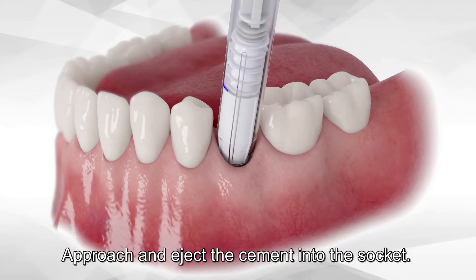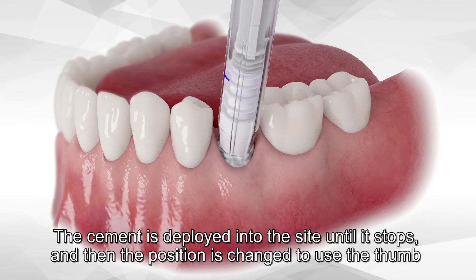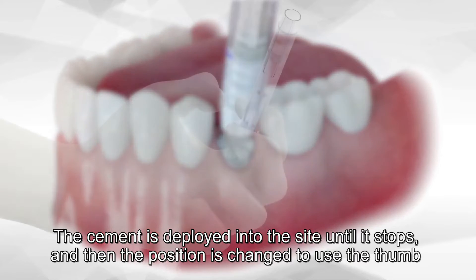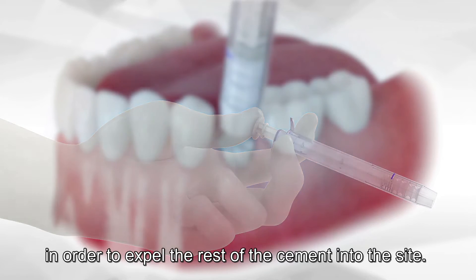Approach and eject the cement into the socket. The cement is deployed into the site until it stops, and then the position is changed to use the thumb in order to expel the rest of the cement into the site.